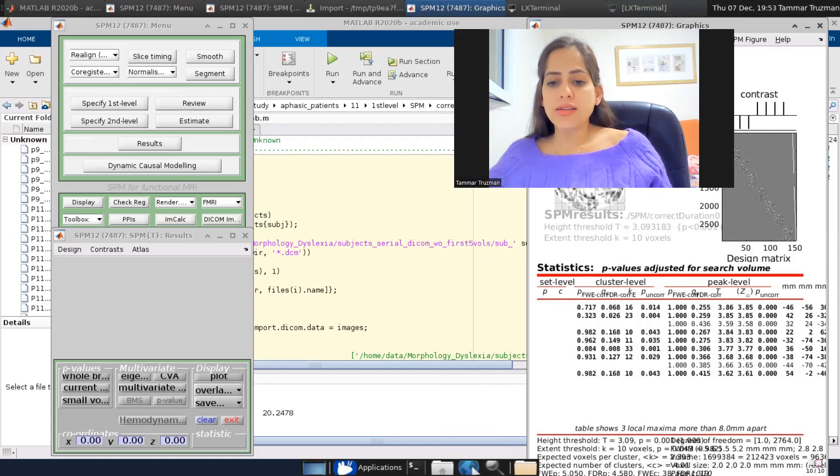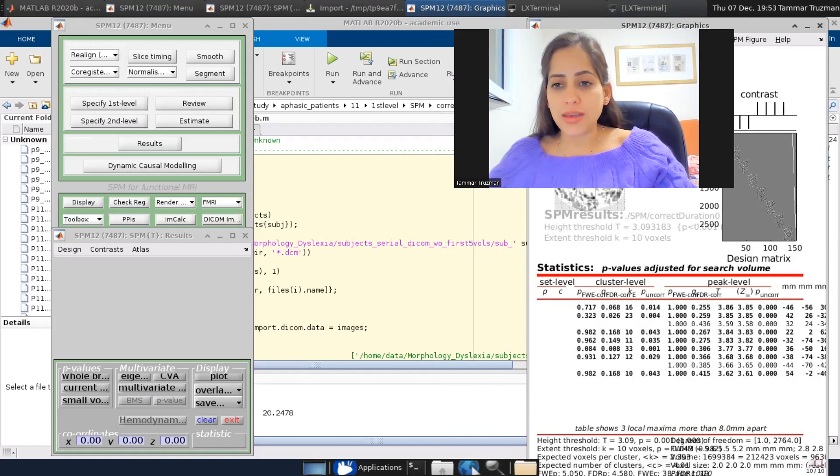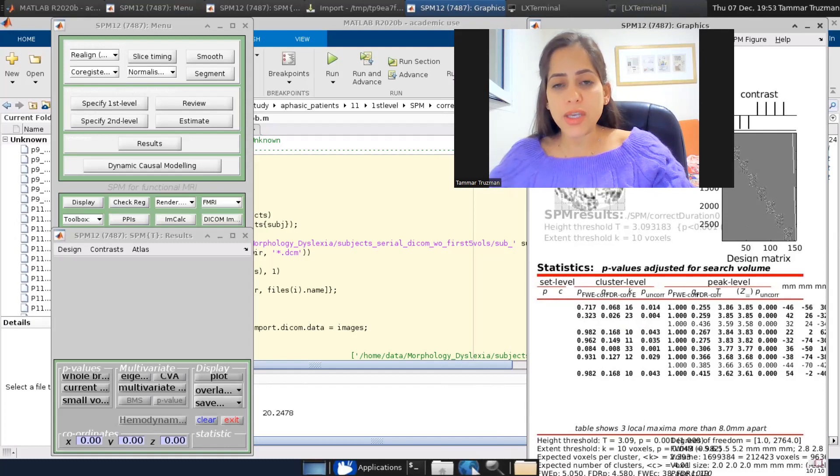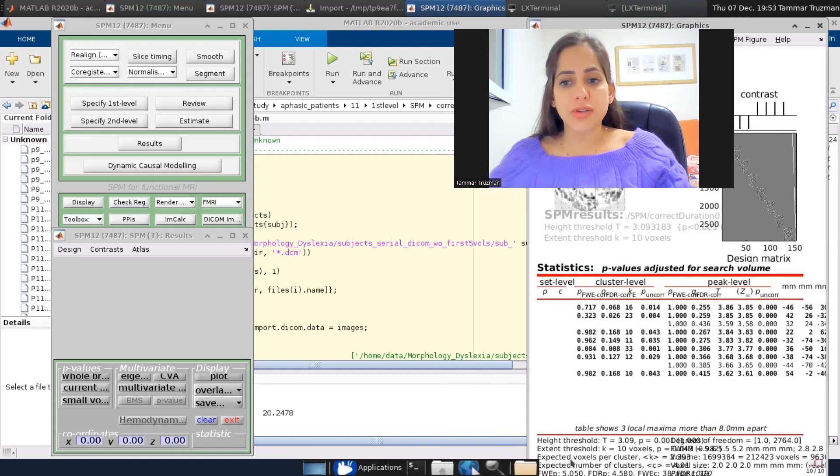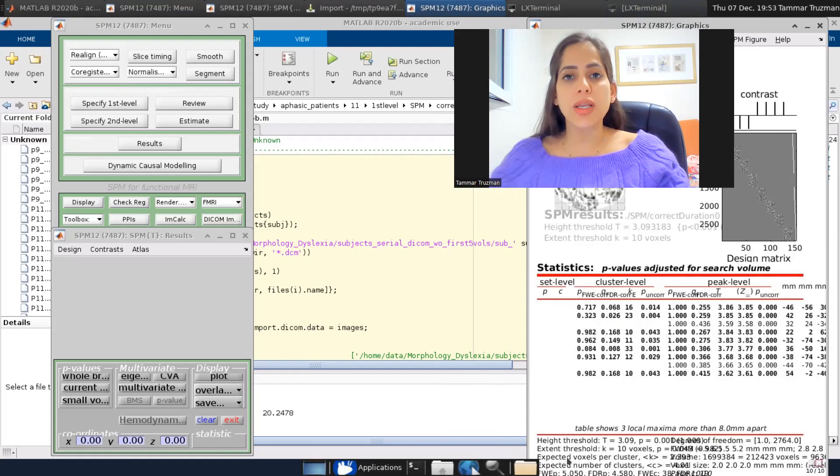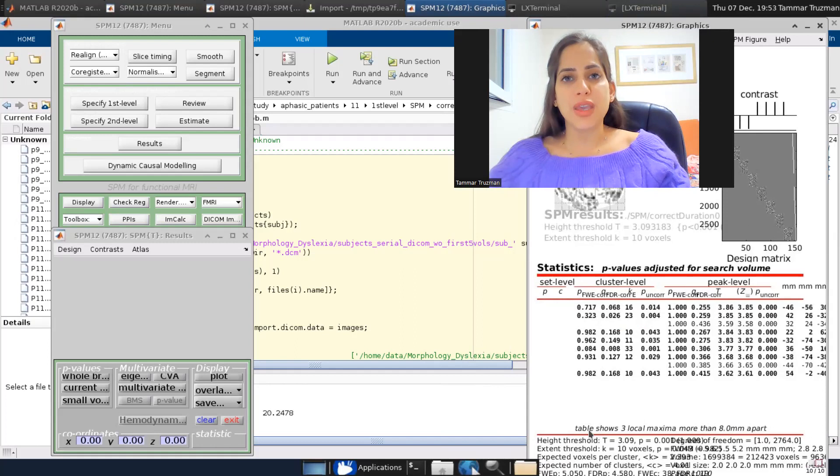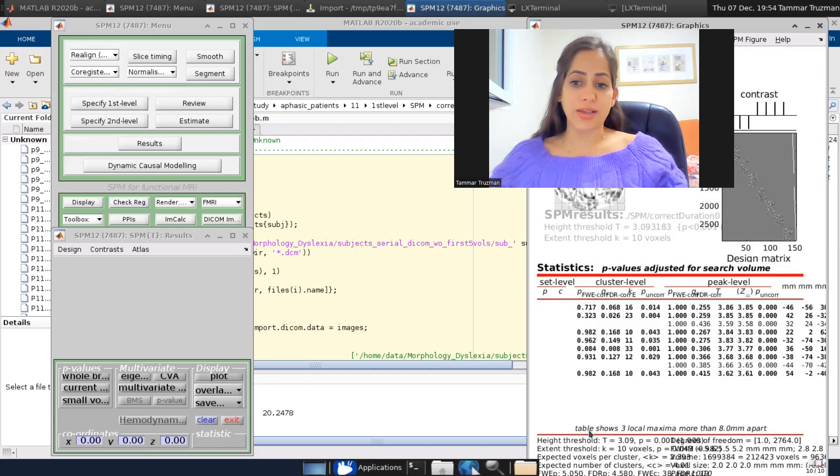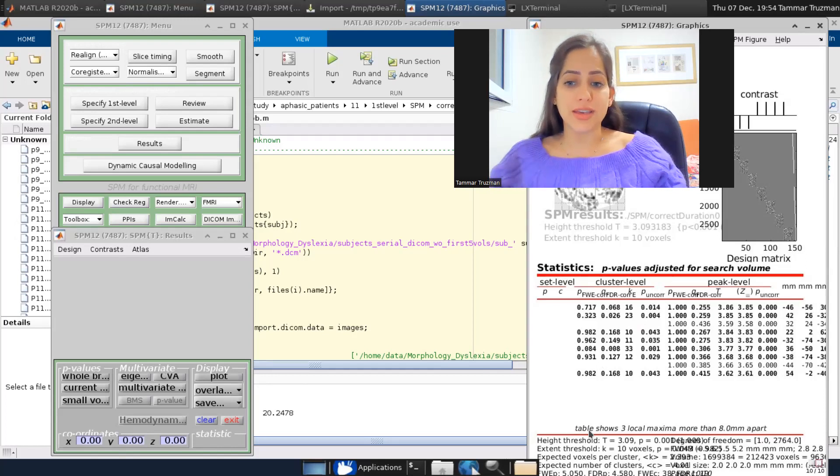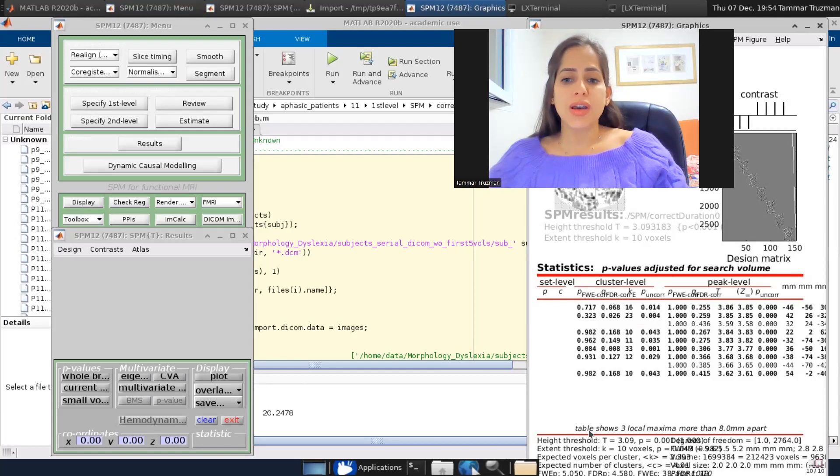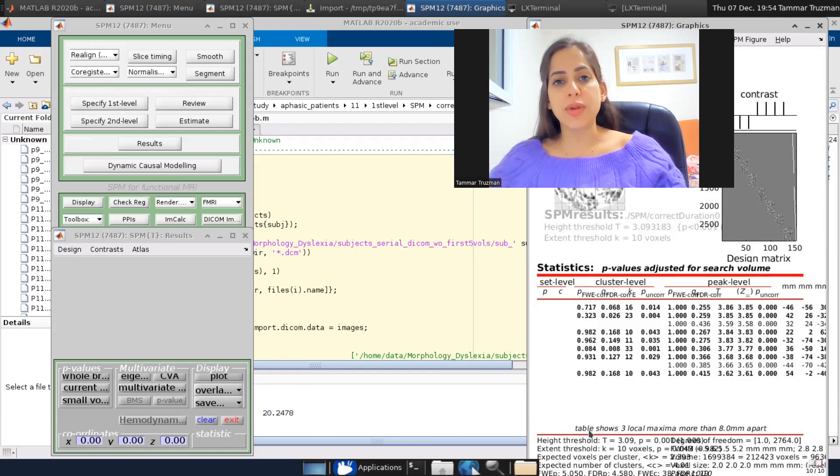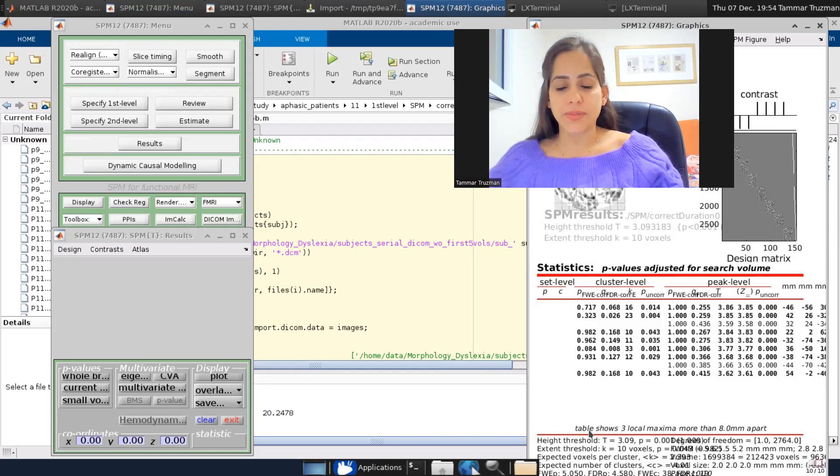And the family-wise error p, the family-wise error T, the high threshold of 5.05 is the threshold that if we will use it, we will get multiple comparison correction of p value equals 0.05. So it's just for an idea. This is the T or the high threshold you would use if you will choose the family-wise error correction at the beginning.